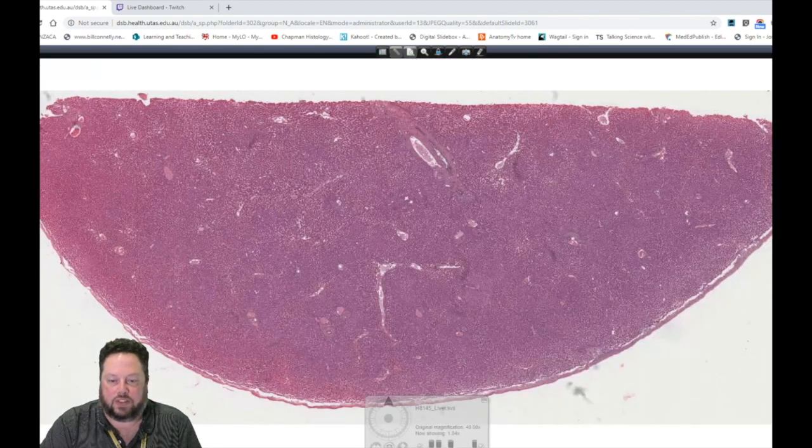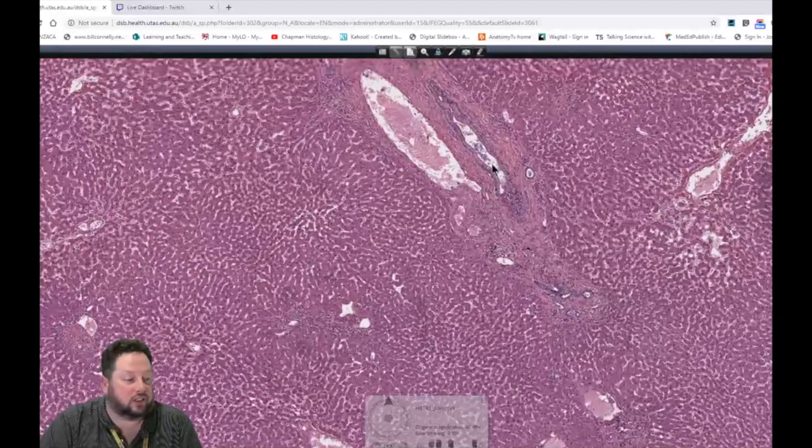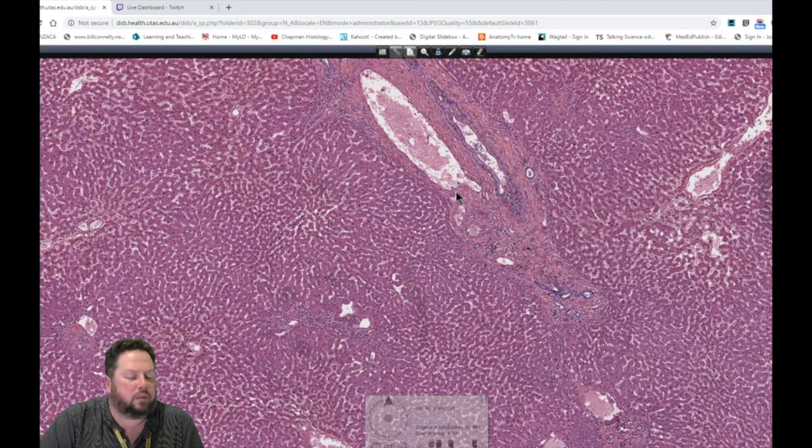Yeah, so we've actually got this section which we never came back to. Is there a use for the portal lobule model? Isabella, use, not really. It's just another way to think about the liver structure in terms of function.